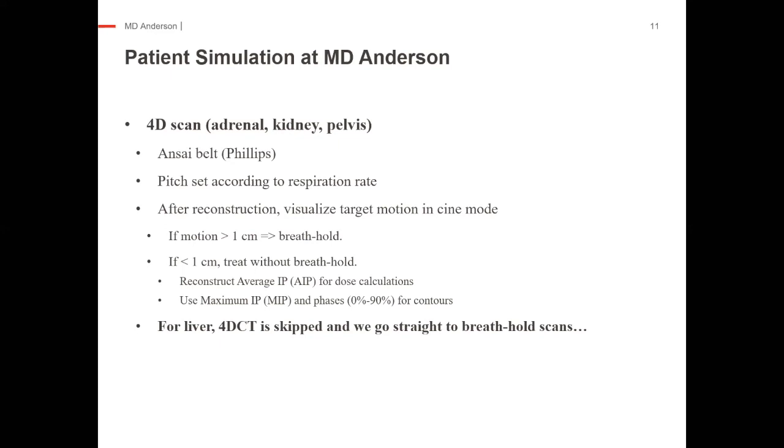For liver in particular though, we skip straight to the breath hold scans. We assume that the liver is going to move on the order of 1 to 2 cm. And so we go straight to the breath hold.